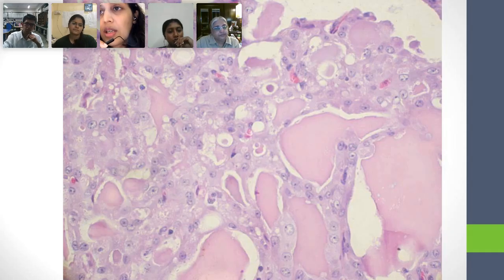Then there are these multiple vacuoles in the cytoplasm. Excellent. Then the nuclei look round to oval. Some of them are even showing mild pleomorphism, different sizes. Different sizes is not pleomorphism. Pleomorphism is different shapes and sizes. What is different sizes called? Anisocytosis. That's for the cell. If it's the nucleus, then anisonucleosis. All right.